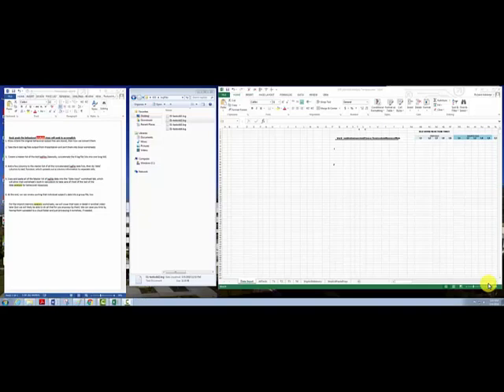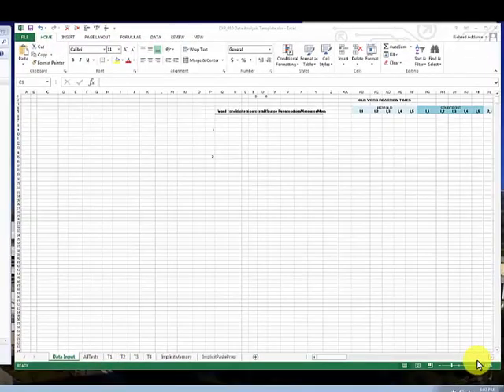All I want to show you today is how to show the patients their behavioral performance, which basically means how do we take their log files, their output from their behavioral responses, and generate some patterns of their performance. So we'll do a couple steps along this way.